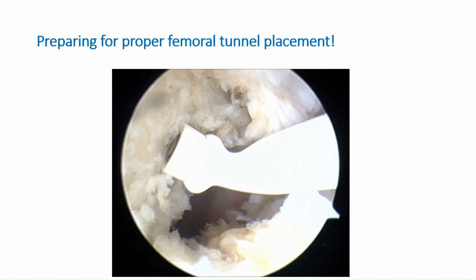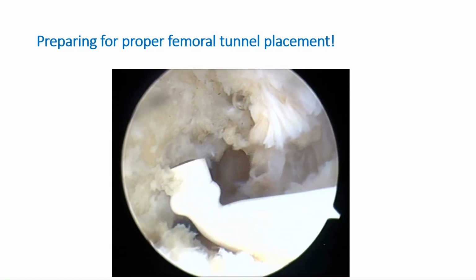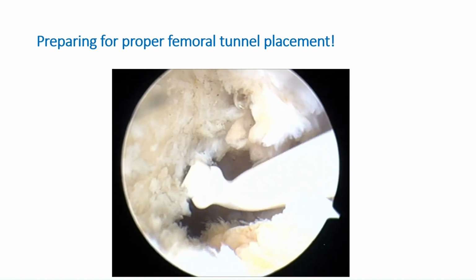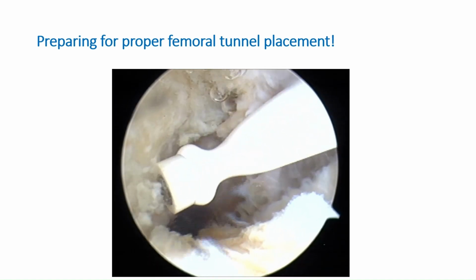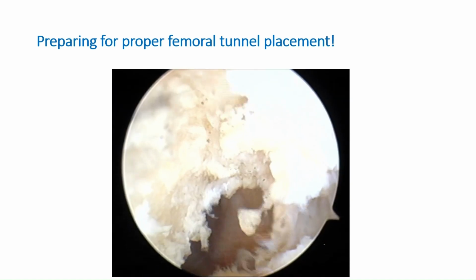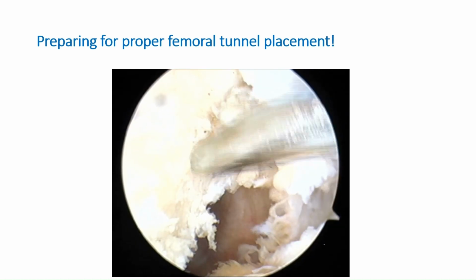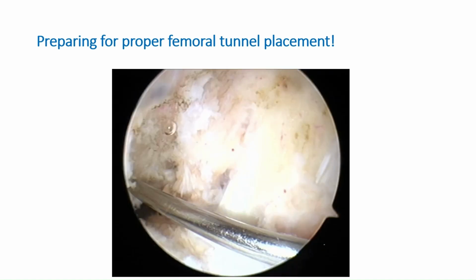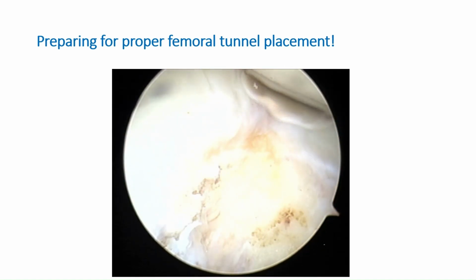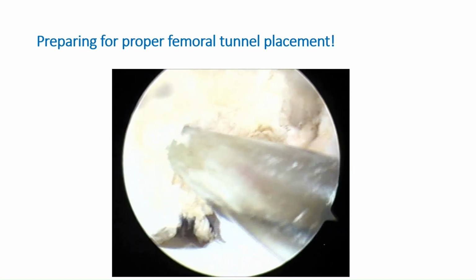What we used to do, this is again a right knee looking from the anterolateral portal, is to remove the whole femoral attachment to have a wide view of where we would like to put our graft, and then say this is the over the top position, this is the lateral intercondylar ridge, and then we will be below the ridge midway between up and down to be on, for example, the 10 o'clock position for the right knee and do our graft.